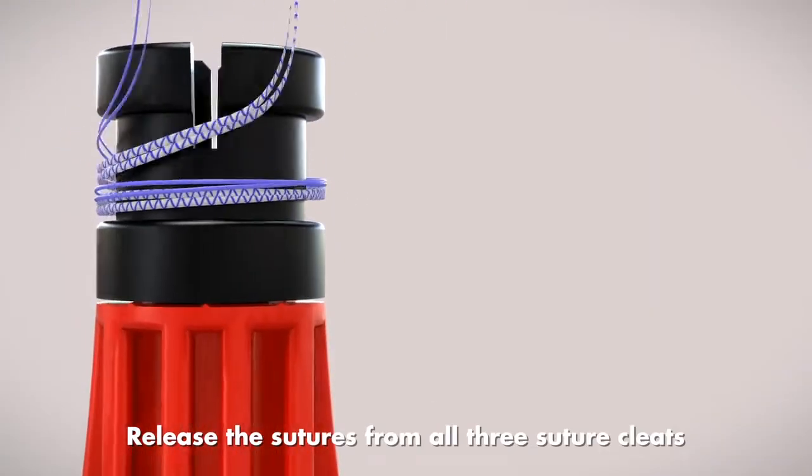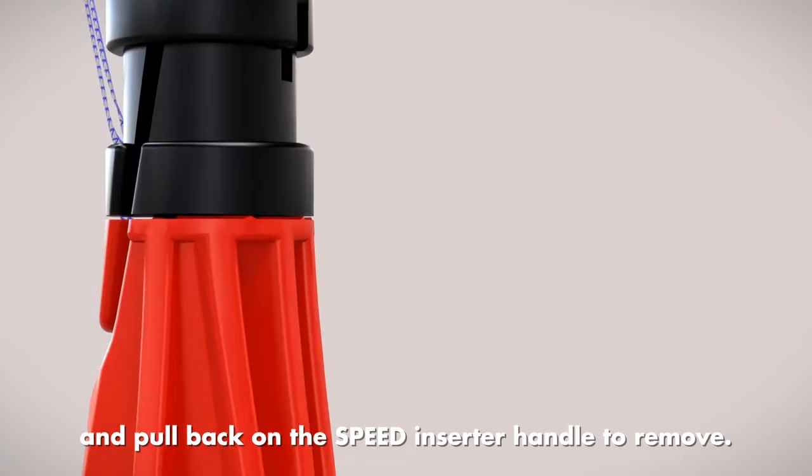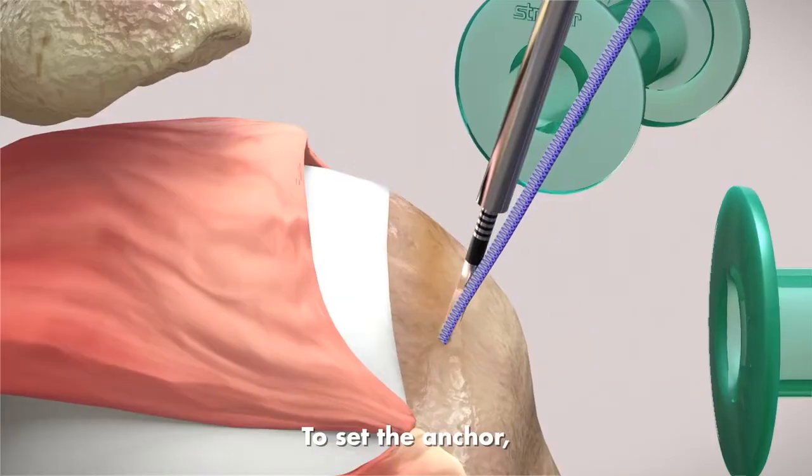Release the sutures from all three suture cleats and pull back on the speed inserter handle to remove. To set the anchor, slowly pull all suture limbs simultaneously.